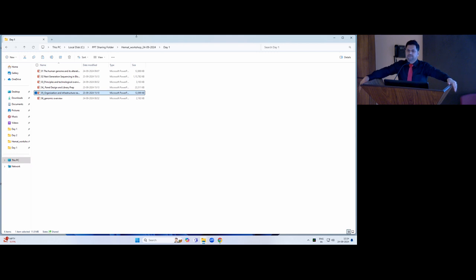Hi. As you told, sir, in case of lymphoma, you reached 150 genes only. So what is the superiority of NGS over MLPA? Even in MLPA we can go for 200 genes. So the simple thing is MLPA is one additional test. In a single NGS test you can do CNVs, mutation detection, and fusions also. With MLPA, you have to do NGS anyway.